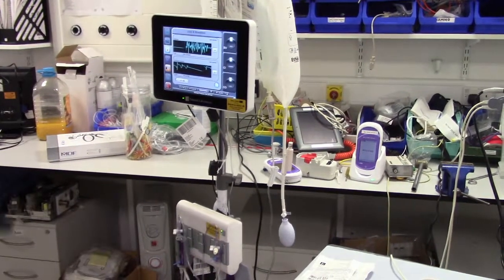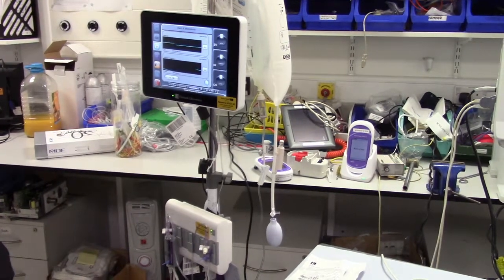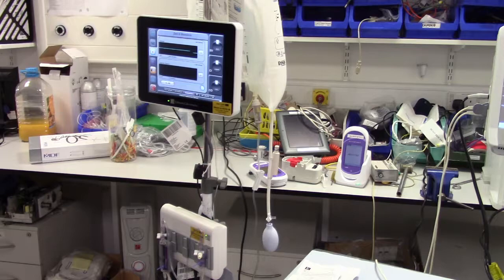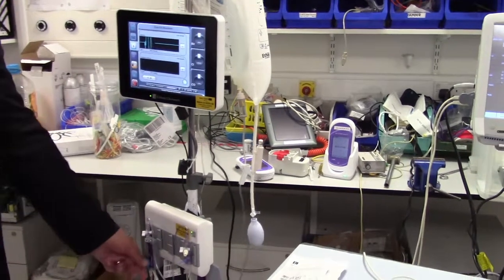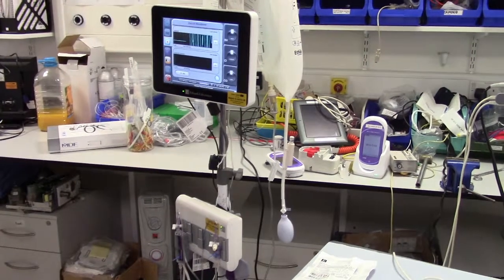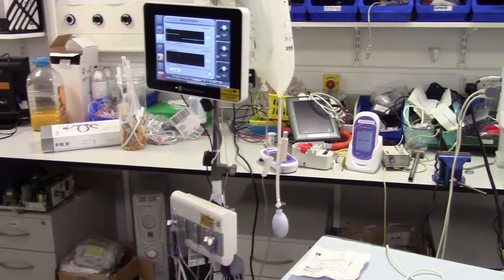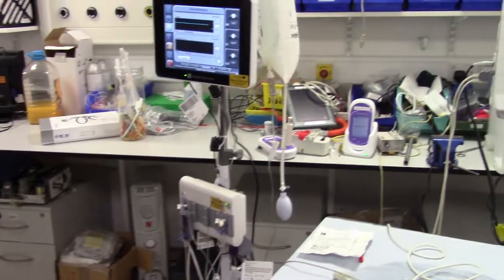It must be a useful test as well, because that means you can make sure it's all connected before you start trying to do fault finding. You can do that quickly, and I can see very quickly that I've got the right signal coming back to the monitor. What I'm saying is if someone had misconnected these the wrong way round, you'd know very quickly and can spot what's wrong.